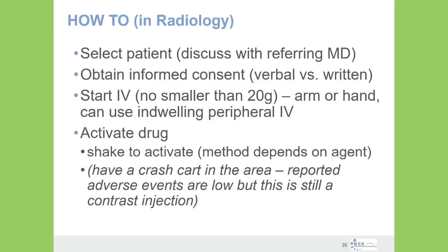It is important to have a crash cart in the area in the same way that we do for CT or MRI contrast. Ultrasound contrast agents have a low rate of reported adverse events, but we are still injecting contrast into the patient. So we would not inject without a physician on site, and we would not inject without access to a crash cart like any other medication that is being used.